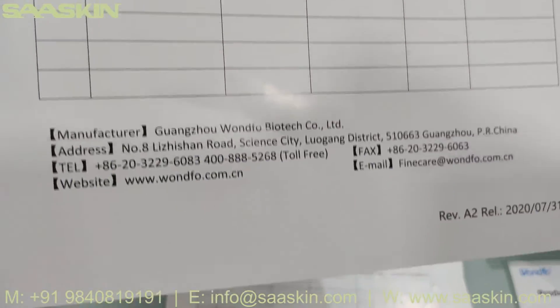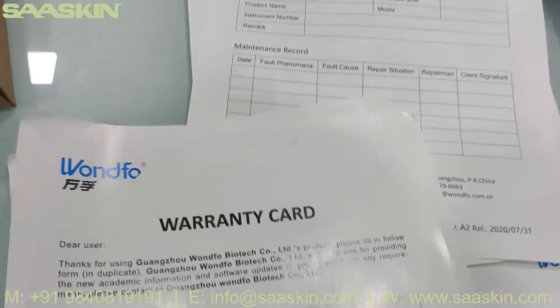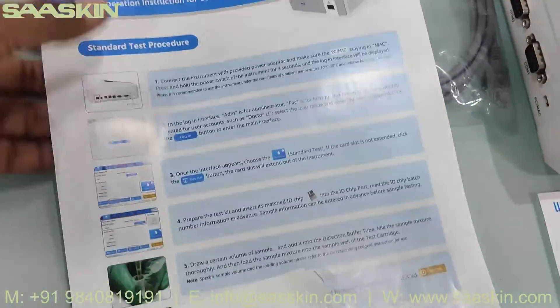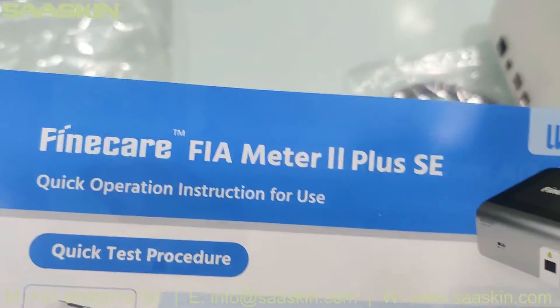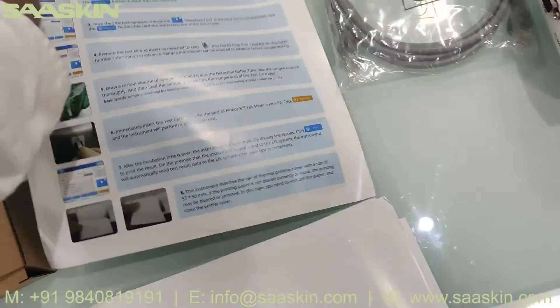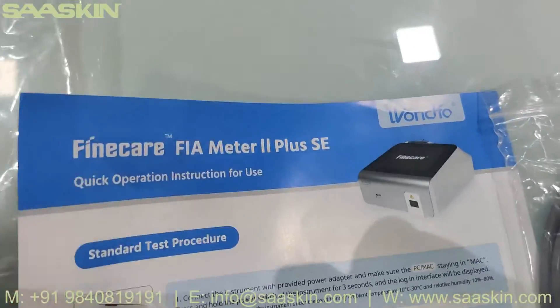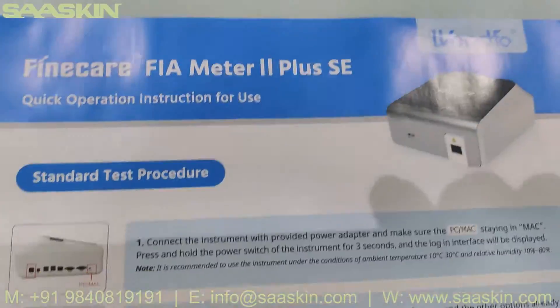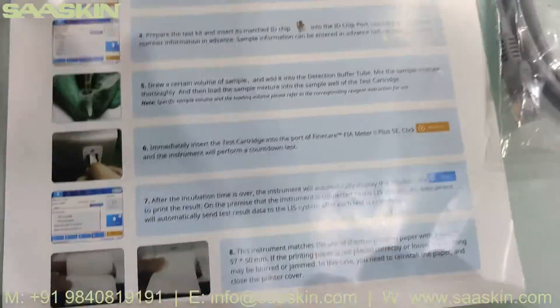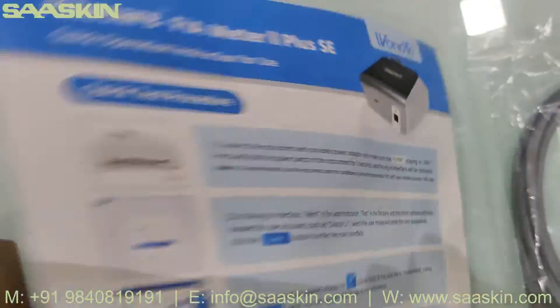There is a warranty card. Once you fill it, it becomes eligibility. There are two forms here. And then there is a general IFU brochure of how to conduct the whole test. Quick operation instruction for use — test procedure. Standard test procedure on one side and quick test procedure on the other side, both given in one sheet.